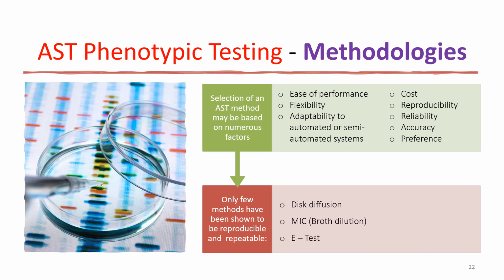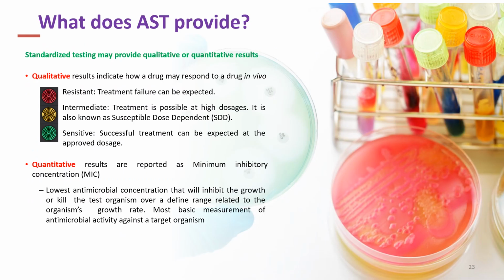There can be disk diffusion or broth dilution and the E-test. It all depends upon the ease of performance, flexibility, reproducibility, reliability, accuracy, preference, and cost that the phenotypic methodology is selected. What does susceptibility testing provide us? It provides qualitative results in terms of sensitive, intermediate, resistant.